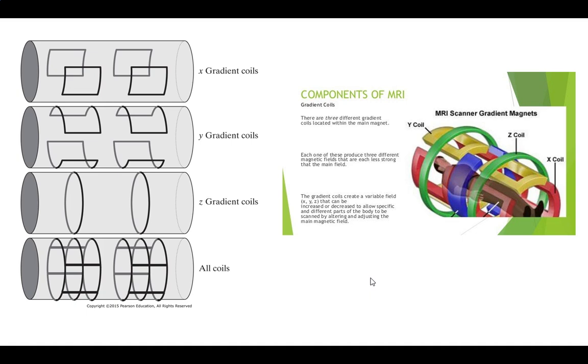This is all spatial encoding. So if you want to put it into a 2-word thing, why have gradients? Spatial encoding. This is basically essential to generating the image itself, resolving individuals.